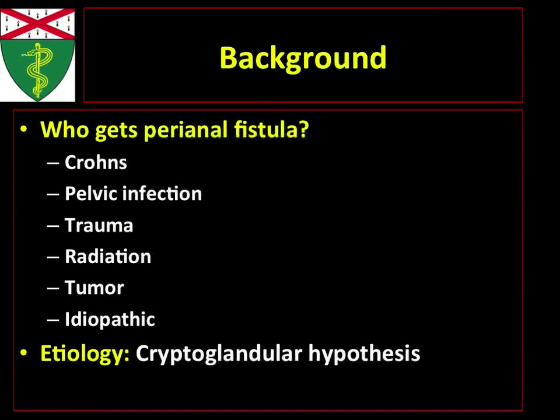And I'll tell you, at least for the residents, this is becoming a very popular thing that our ER physicians order when patients come into the ER. So these are emergent studies. We've been woken up at 2 o'clock, 3 o'clock in the morning to read these studies. So it is important to be familiar and know how to interpret these.